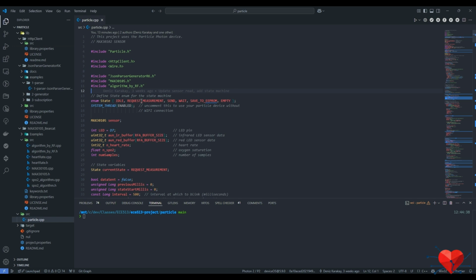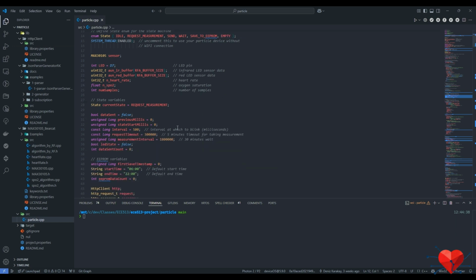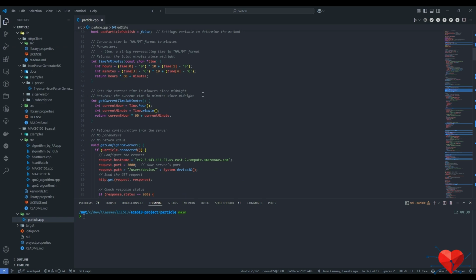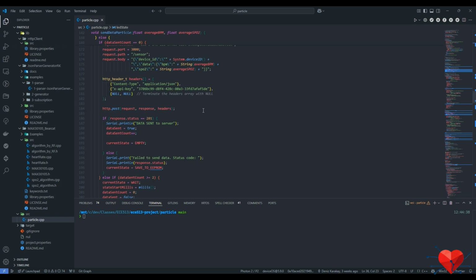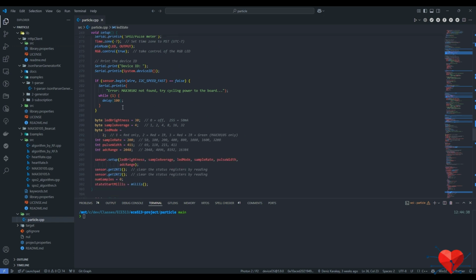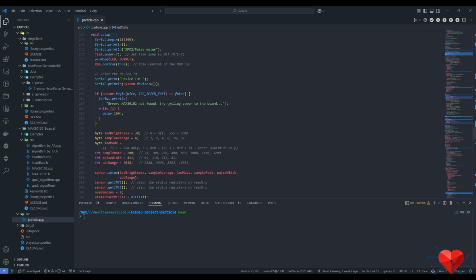I define the state as idle, request measurement, send, wait, save to EEPROM and empty based on the actions that we are doing. So those are the default parameters like 30 minutes wait, 5 minutes timeout, from 6 to 10. But all of those can be modified using our website interface. So let me start with the setup code.